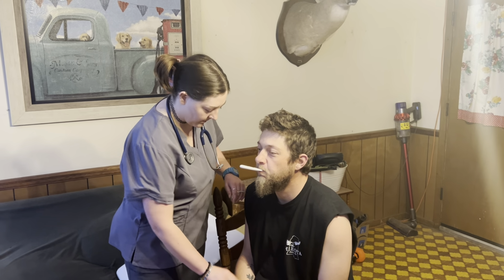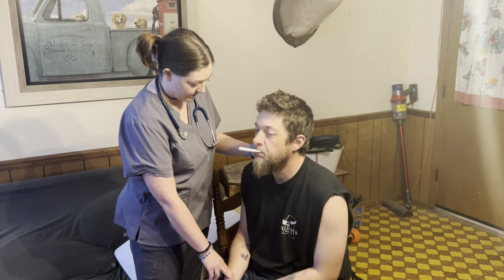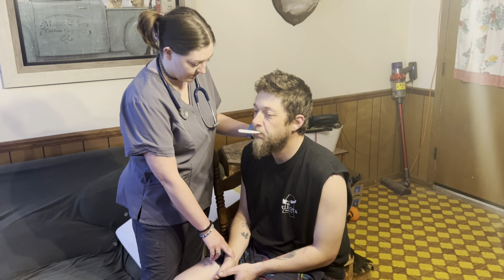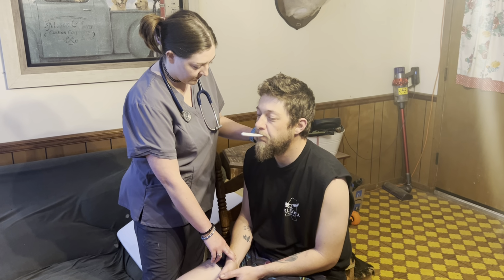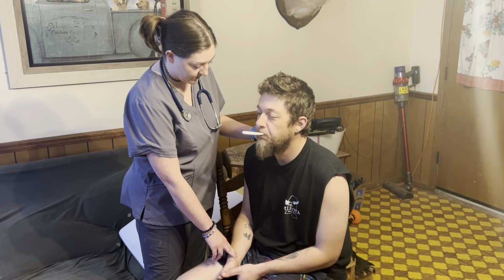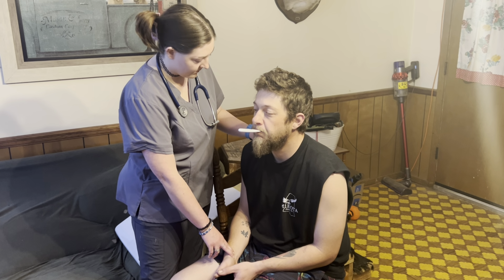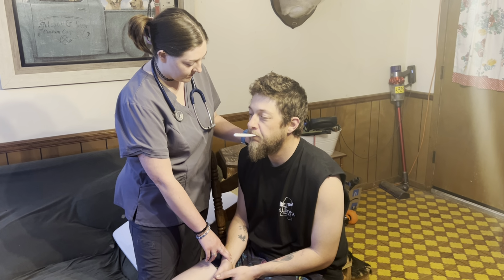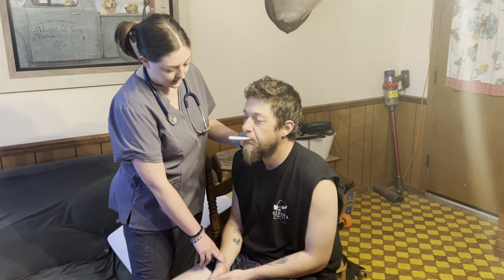All right, I'm going to start by taking your vitals. All right, respiratory rate is 16.